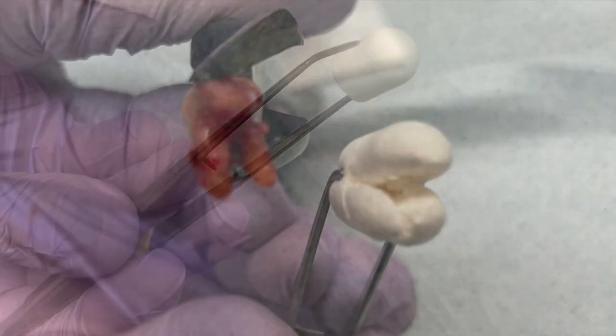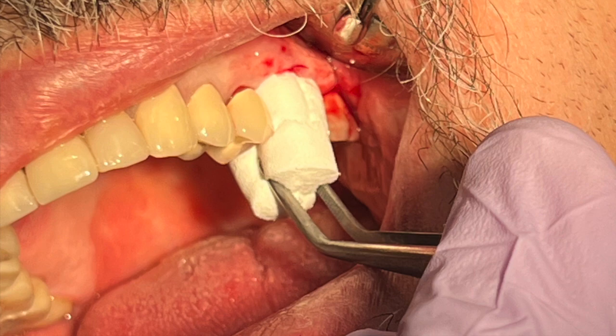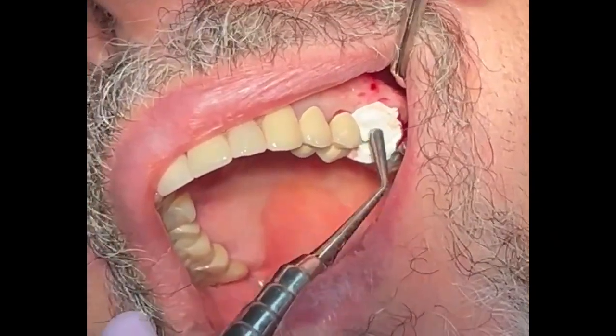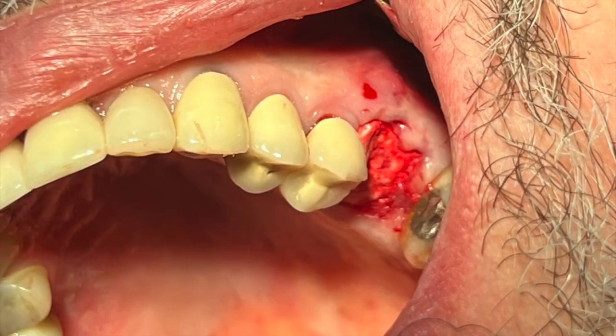Here I've taken an extra large osteogen plug, shaping it like the root of a tooth, and simply carefully placing it into the three sockets. I'm condensing it firmly, but not crushing the material — it's not amalgam. I'd like to place it at or slightly above the crest of the ridge.